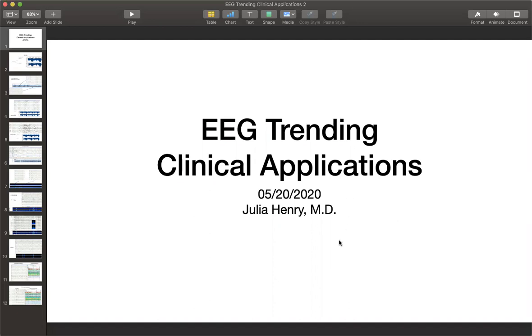Dr. Van Dragen, thank you so much for inviting me to speak to your class about how we use EEG trending for clinical applications. It's something we use pretty much on a daily basis here. Forgive me, I don't know everybody's background, how much they know or have reviewed EEGs, or how much background they have about epilepsy, so feel free to ask any questions as we go.